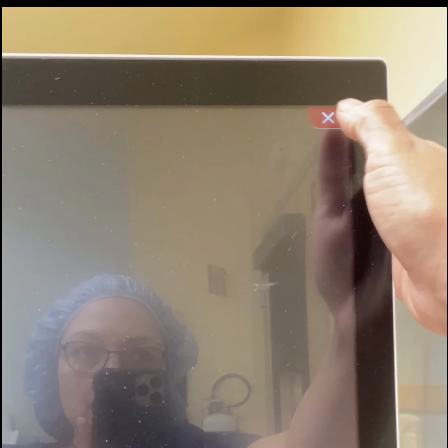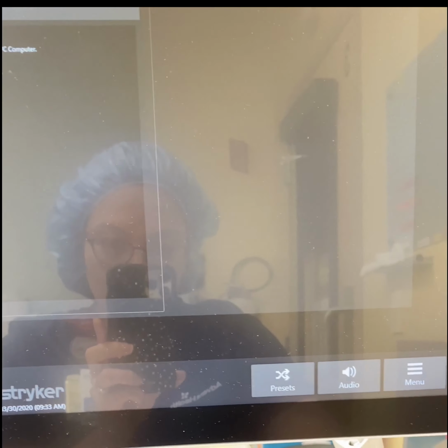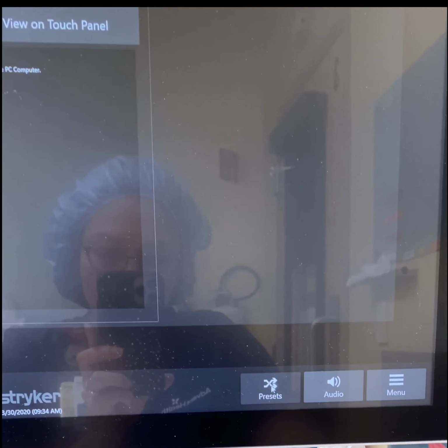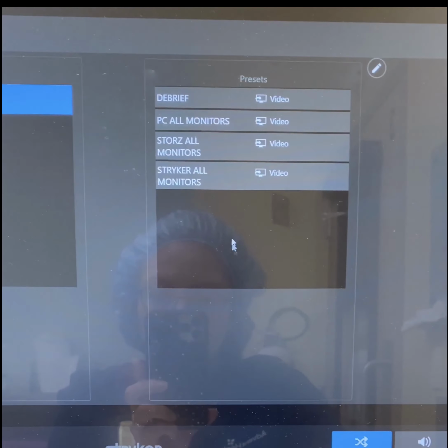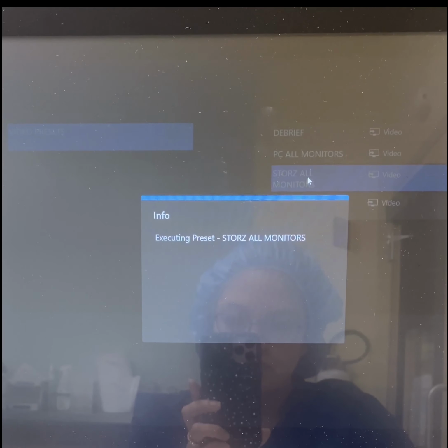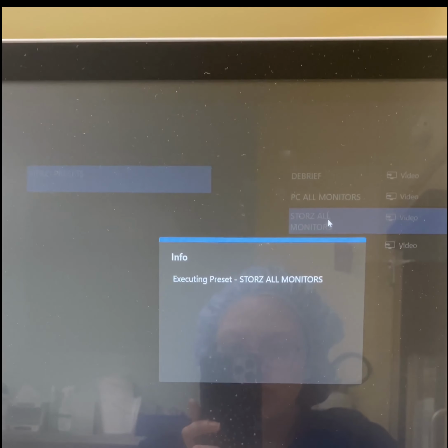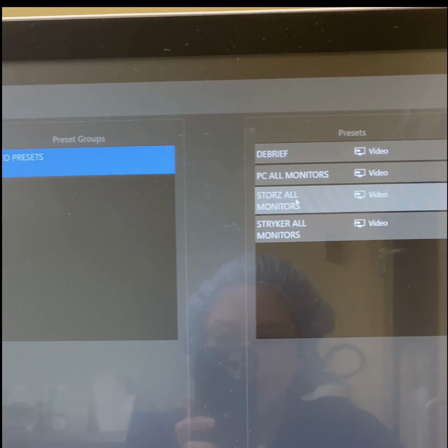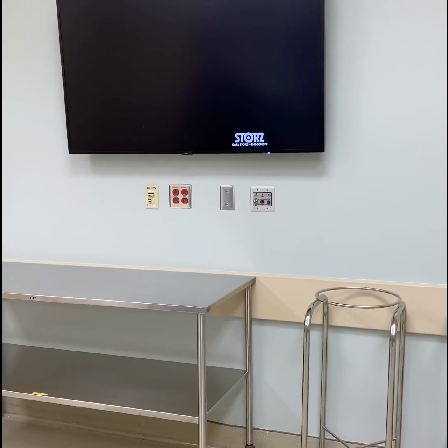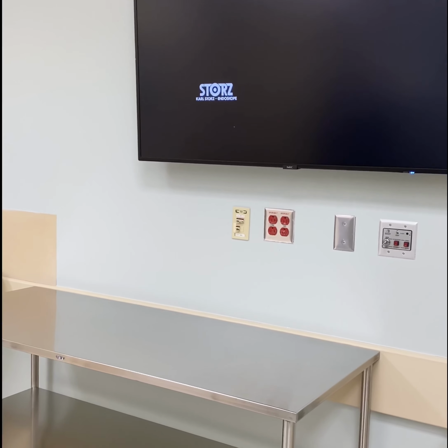The first step is you're going to come out of this by hitting the X. You want to get to the screen that allows you to hit presets. Once you're at the main Stryker screen, you're going to go down to the corner here. You're going to hit presets, and then you're going to hit Storz all monitors. This is just getting you ready so you can use the digital ureteroscope. You have to make sure you do this prior to hooking anything up. You can see after I hit the preset and changed everything to Storz on the big screen and on the monitors, it should flash Storz on there.